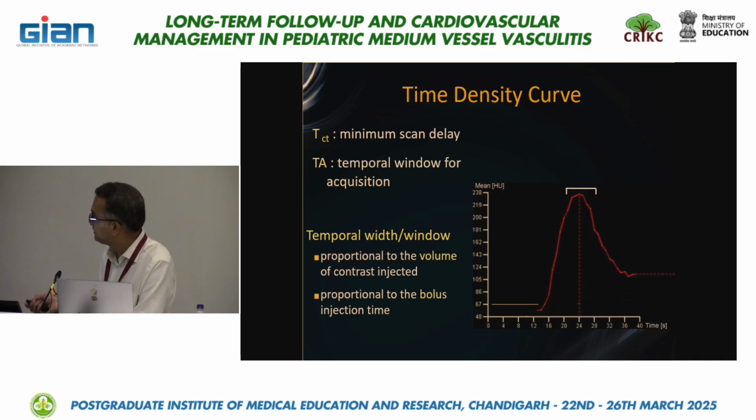And this window is proportional to the volume of contrast injected and the bolus injection time. So if that increases, it can further result in earlier recirculation and poor opacification of the contrast. So optimal opacification during this window is very important.